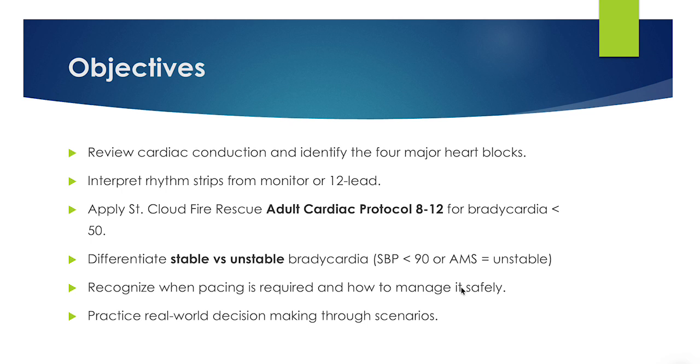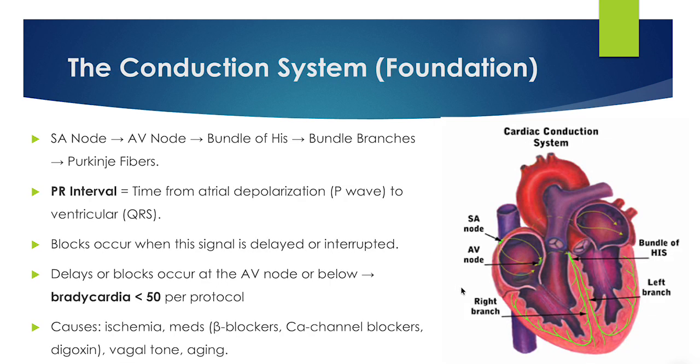We're going to be talking about management of stable versus unstable bradycardia and also pacing, what constitutes a false capture and what constitutes good capture, successful pacing, and how to manage these kinds of scenarios in the field. So without further ado, I'm going to start first with the conduction system.